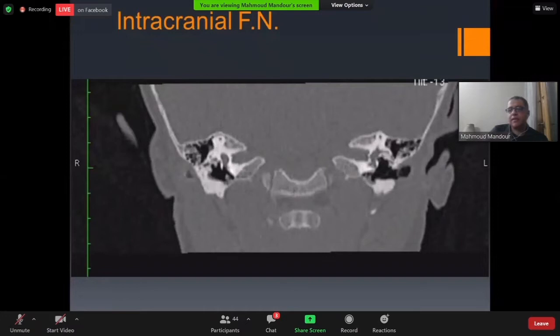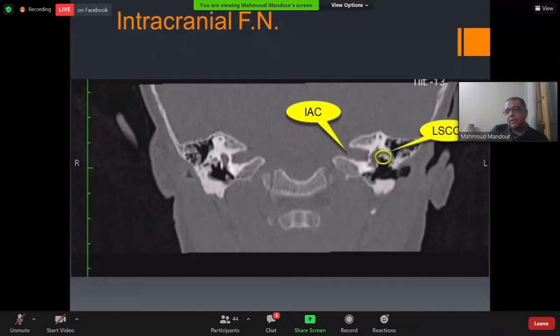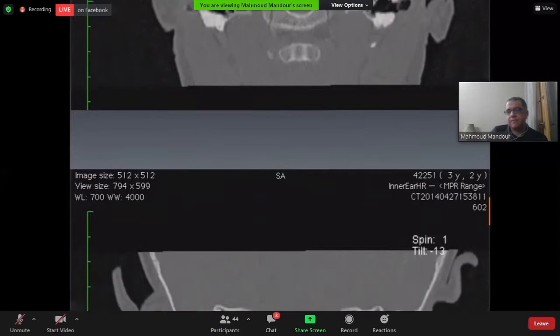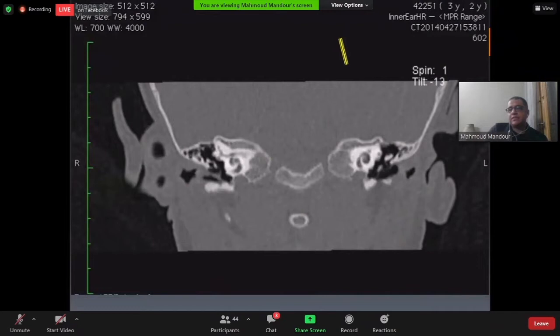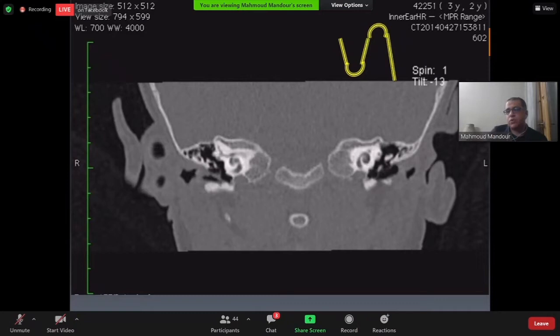Moving anteriorly in the coronal cut of the IAC, we find the lateral semicircular canal and the tympanic segment of the facial nerve beneath it. As the labyrinthine segment passes anteriorly, it turns and then passes posteriorly as the tympanic segment, before making the second genu and passing inferiorly as the mastoid segment.